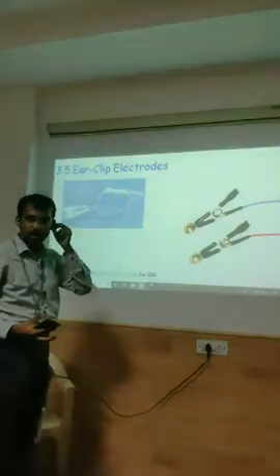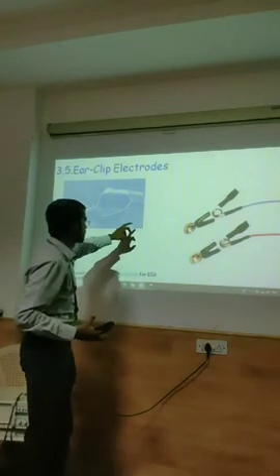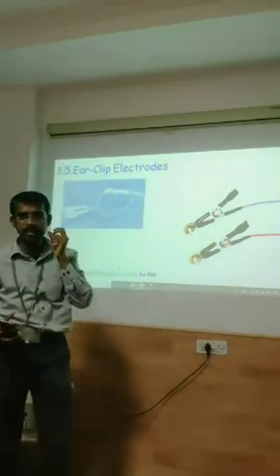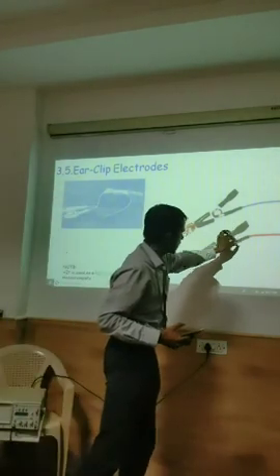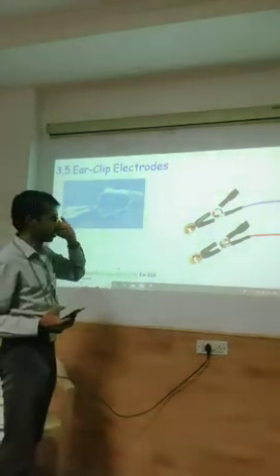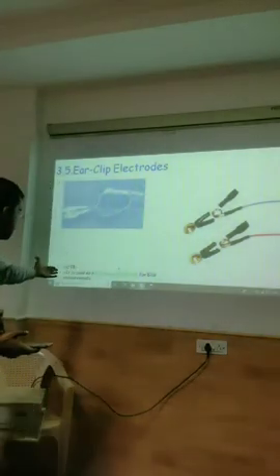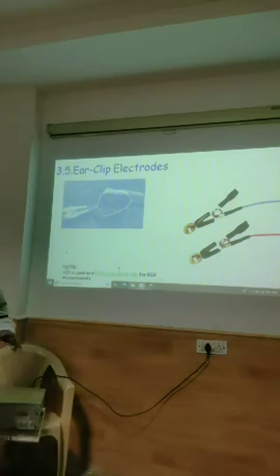So here you need a clip, but the electrode is actually here, from where the signal is taken. It is like an earphone: you have a clip and that's how it goes. You press it, these two parts open, and you can place it wherever needed. This will not pick up the signal; it is used as a reference. So it is used as a reference electrode.